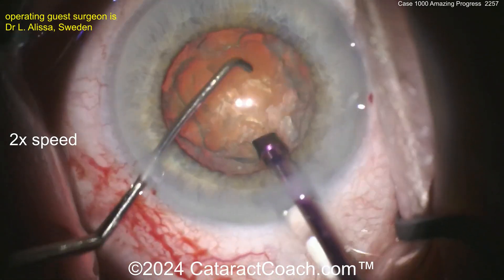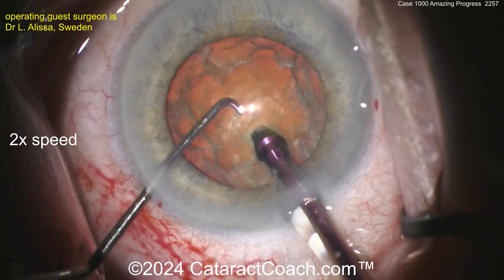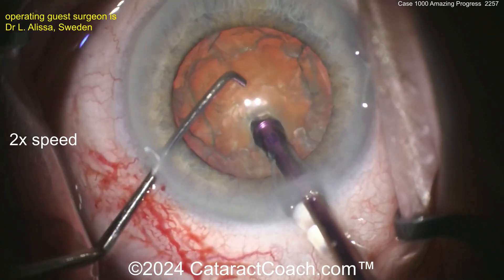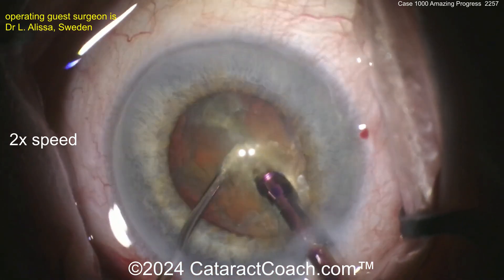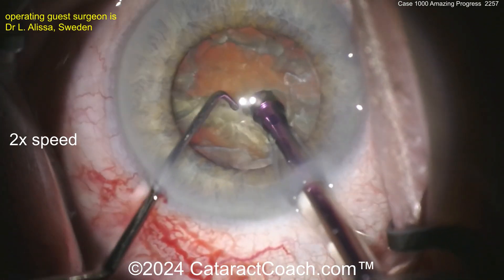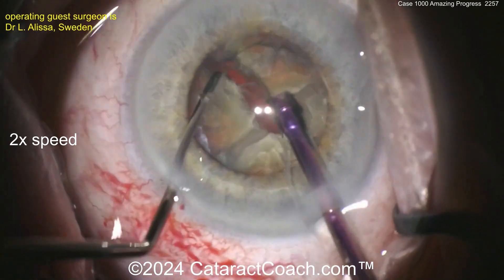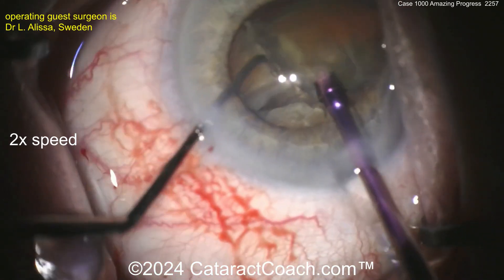Looks like a chop. Buzzing over the FACO probe, getting a good purchase on that nucleus. Horizontal chop, beautifully done — so efficient. Rotating that nucleus, beautiful nucleofractis technique here. I do like this horizontal chop technique. It looks really good.